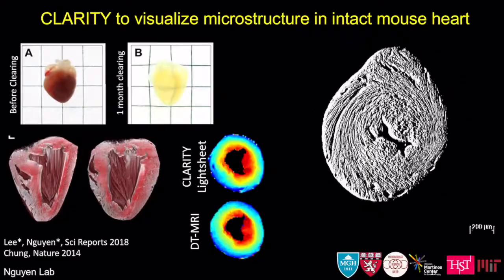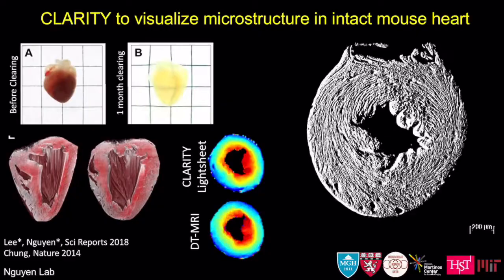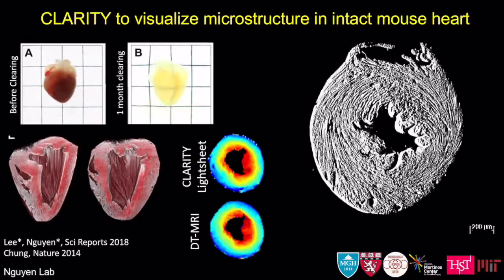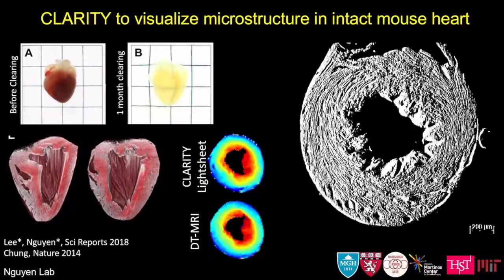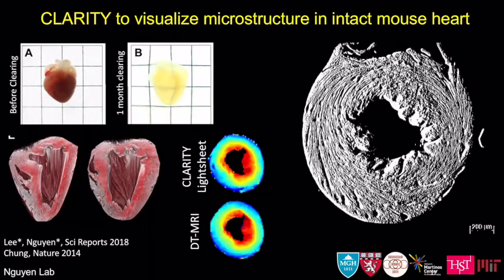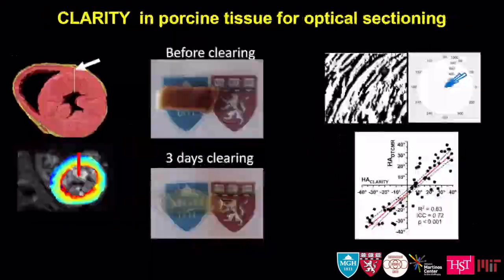And then we said, okay, now we're imaging the fibers. And now in that same heart, we're going to do some ex vivo DTI just to demonstrate and make sure. The proof of concept is that you would do an in vivo image, then you would do an ex vivo scan, or you just do the in vivo image, and then you take the heart out in animal models, of course, and then check again. We did that, and we showed that it works very, very well. You can see even in this GIF file that it has this circular swirling pattern, because in fact it does have that double helix that we saw.